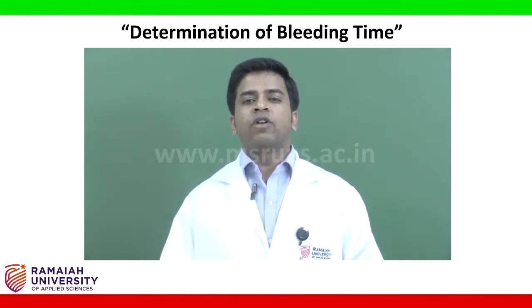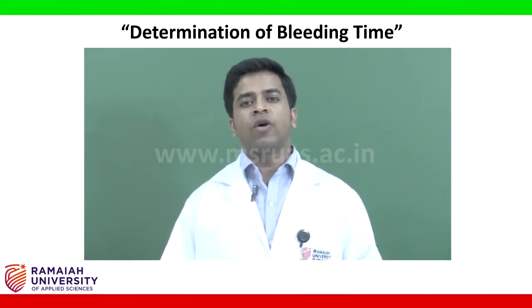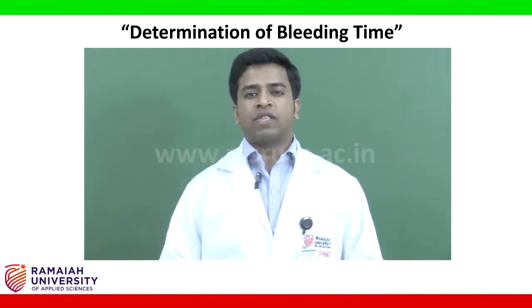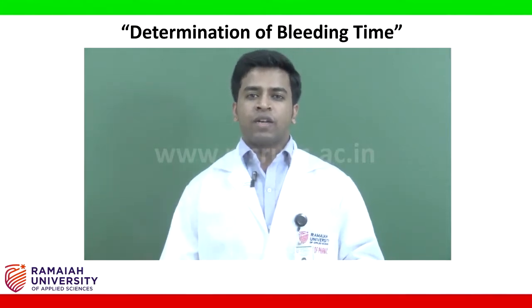It is one of the hematological experiments which is most of the time performed along with other coagulation tests such as prothrombin time, fibrinogen and platelet count. The purpose of this experiment is to aid in the diagnosis of patients suspected of having a bleeding disorder. Now, let us study various requirements involved in this experiment.